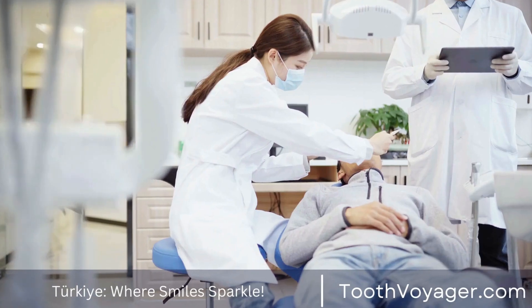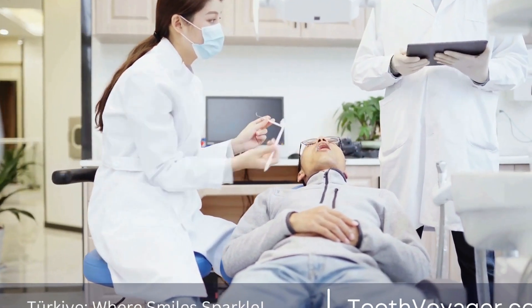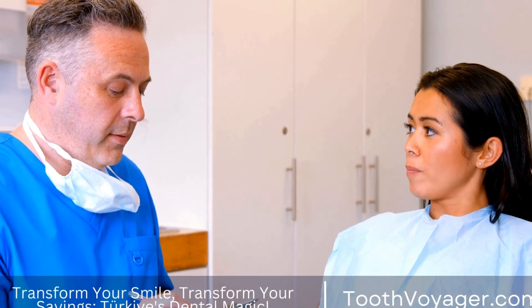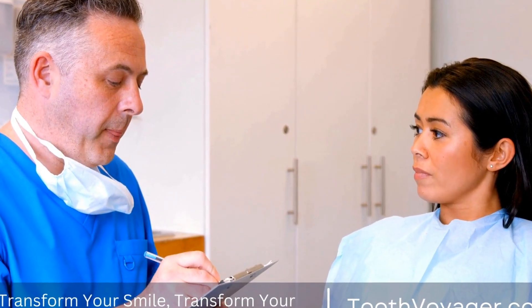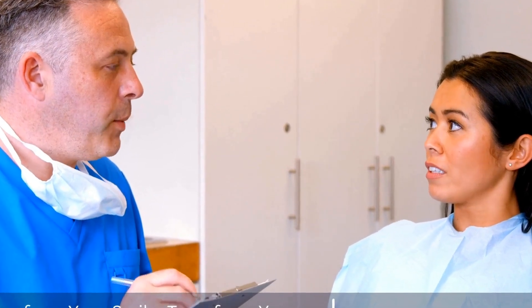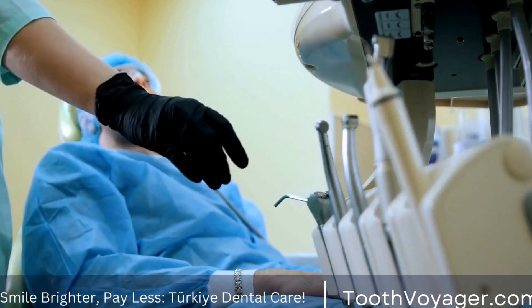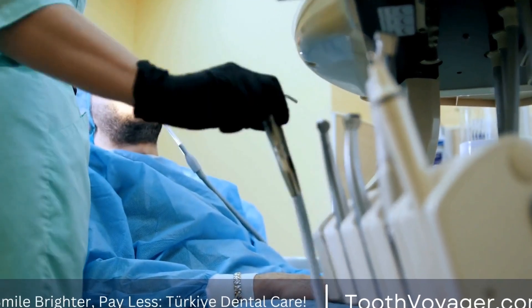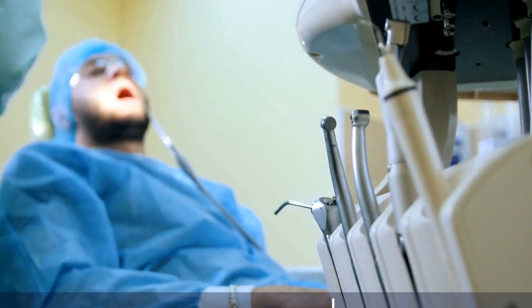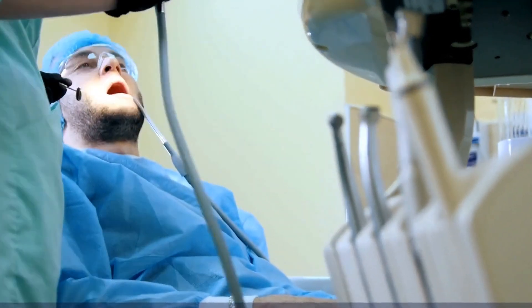After the impressions have been taken, the dentist uses them to create the dentures. The process involves deciding on the suitable materials and then creating the prosthetics to guarantee an ideal fit. Customizing dentures to fit comfortably may also require altering the shape, size, and shade of the prosthetics so that they match the natural teeth of the patient and improve the appearance of their smile.